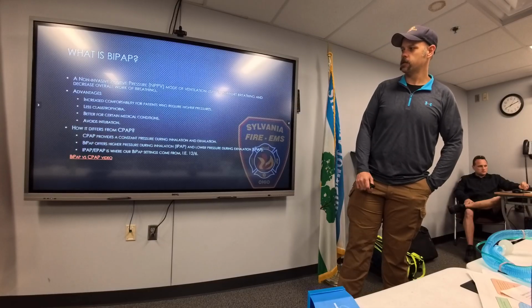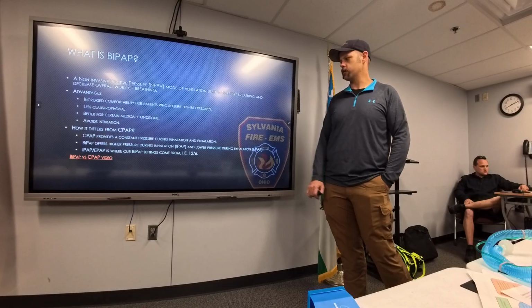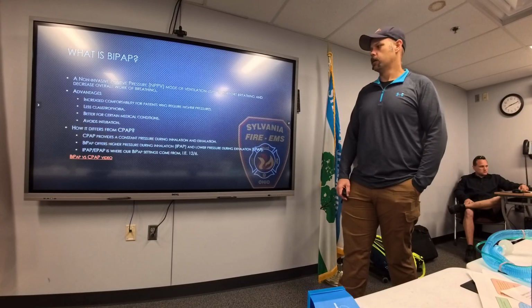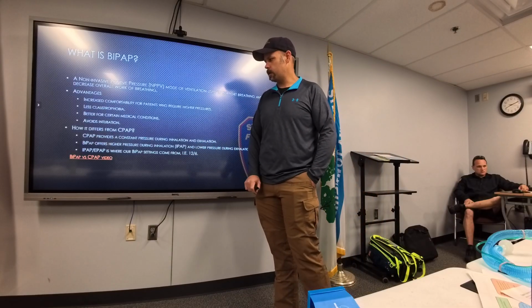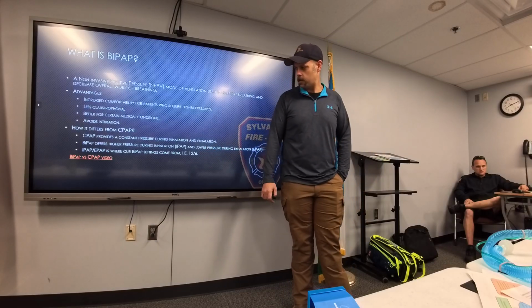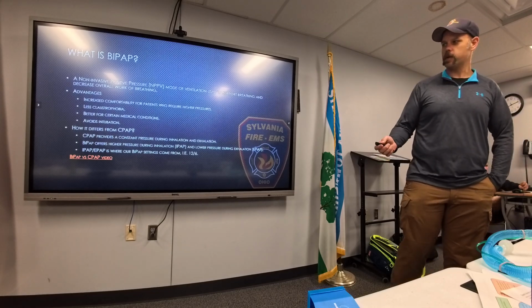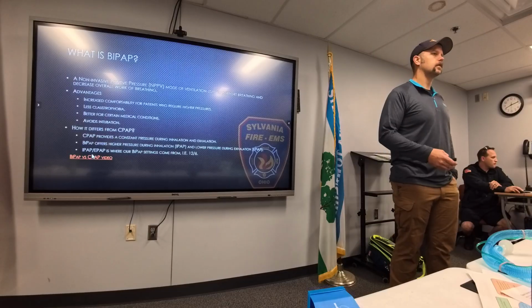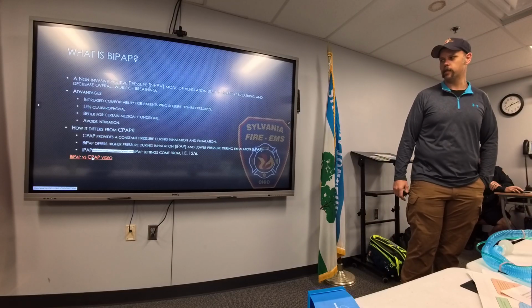How it differs: CPAP is constant. BiPAP offers that higher pressure during inspiration and then that lower pressure. So, like I said just a minute ago, IPAP over EPAP is where our BiPAP settings come from. So 12/6. I've got a short video here, and we'll breeze through it. It explains a little further in depth the differences between BiPAP and CPAP.